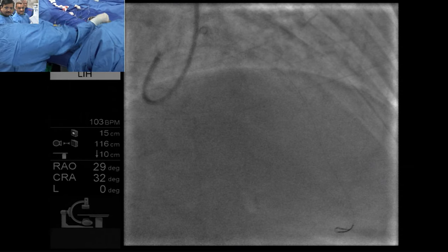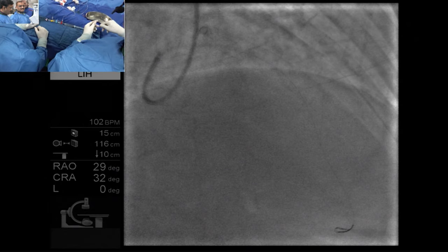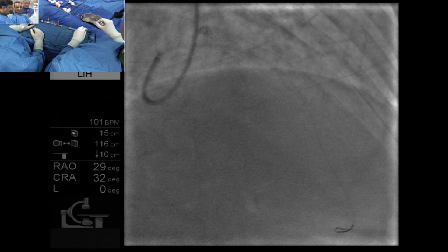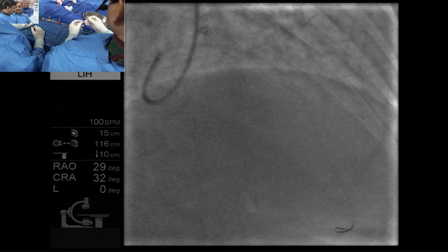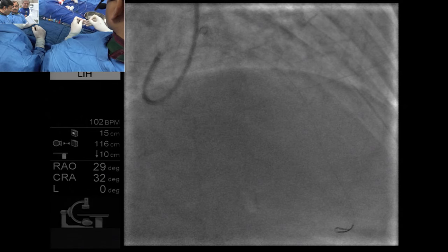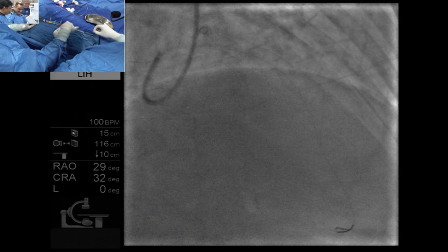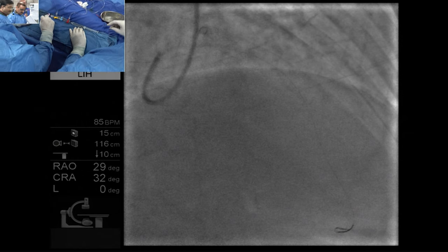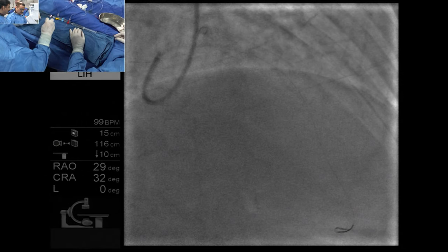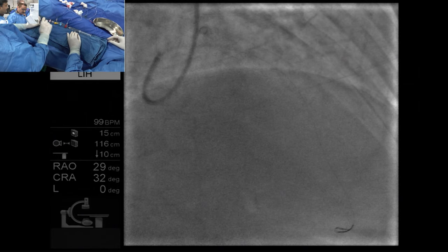Now Tak is going to talk about my IVUS. You do an IVUS, right? Yeah, only for you. Why IVUS? To see whether we have to do rotablation or not, or just primary stent it. No, I was told to do IVUS actually, Tak. I know. That's the question you asked me yesterday. You forgot, right?